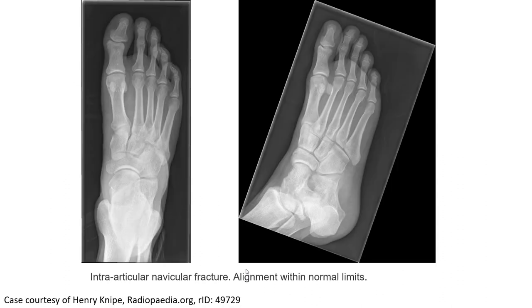This is an example of a navicular fracture within the joint, and the large one is normal. As you can see, there is a lucency line with small fragmentation. On the frontal view, you can see a lucency line across the medial aspect of the navicular.